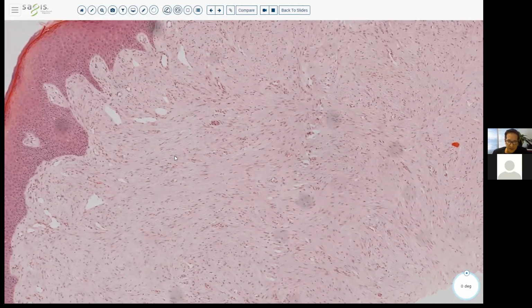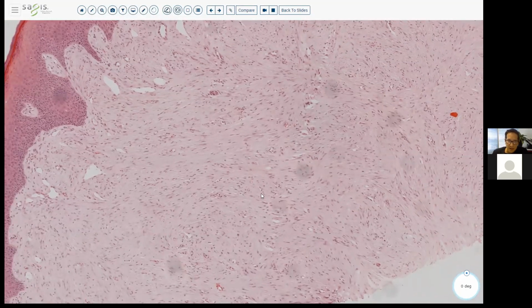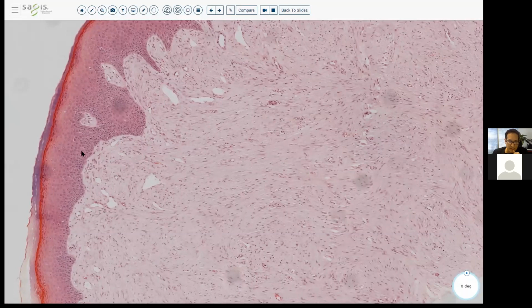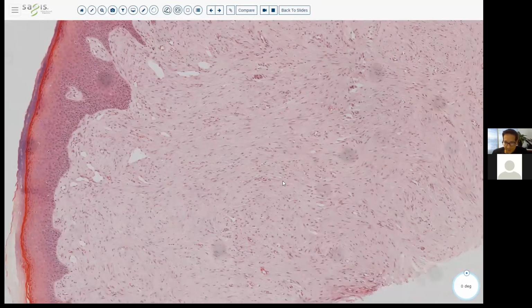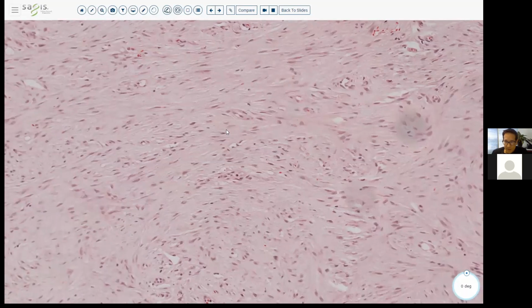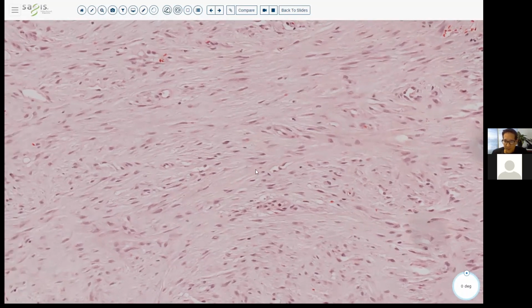You've got these large blood vessels, so it almost looks like a fibrous papule. But we are not on the face. We are actually on the hand, or probably the hand or the foot. This is kind of reminiscent of acral skin. So wanted to zoom in here, and you can see red blood cells. These are red blood cells within small blood vessels and capillaries.